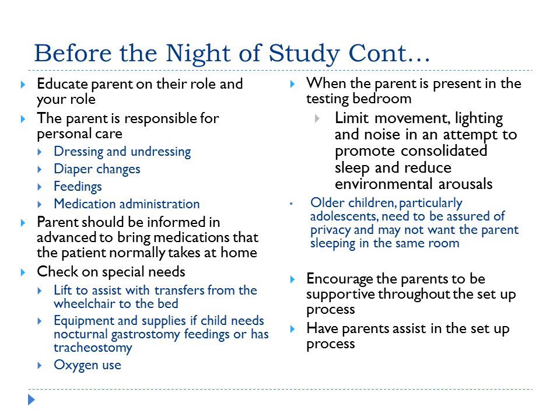Whatever is needed at home, you want to make sure it's available on the night of the study and it's ready to go. When the parent is present in the testing bedroom, you want to instruct them to limit their movement, limit the lighting, and limit noise. This is to help promote consolidated sleep and reduce environmental arousals to get the best quality data possible.